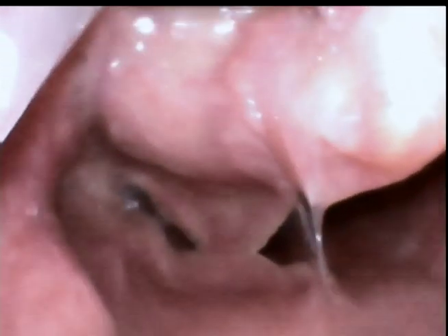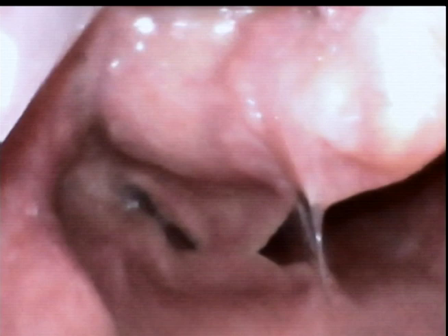In this laryngoscopy using a U-scope, a deep dive with a laryngoscope blade results in an odd picture. It is difficult for the laryngoscopist to interpret the anatomy being imaged.